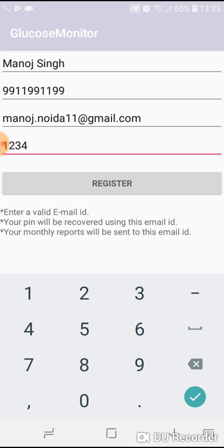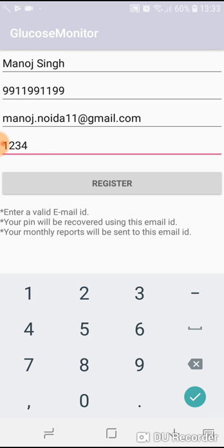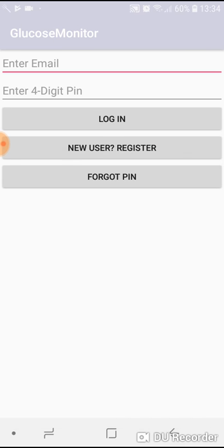At the bottom of the screen you can see some messages like 'enter a valid email ID, your pin will be recovered using this email ID' or 'monthly reports will be sent to this email ID'. So email ID is very important to remember.